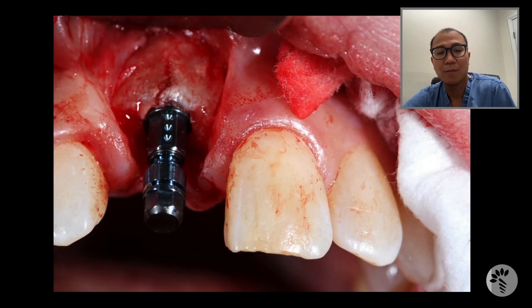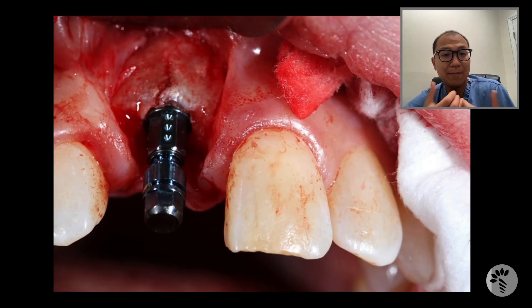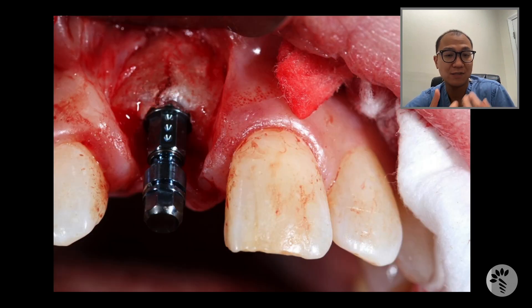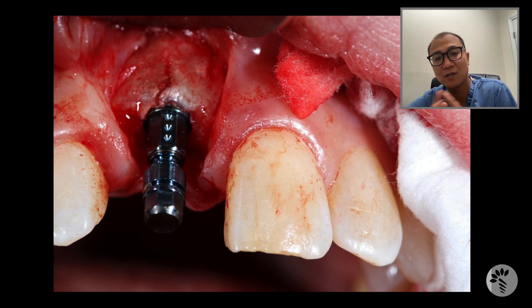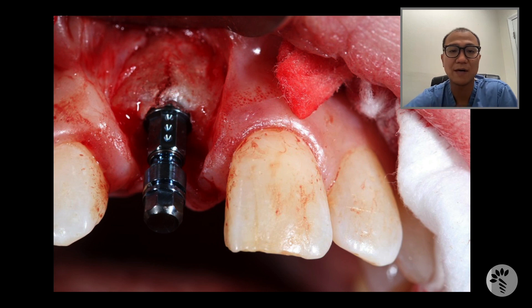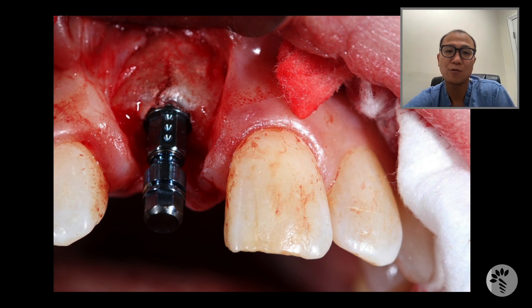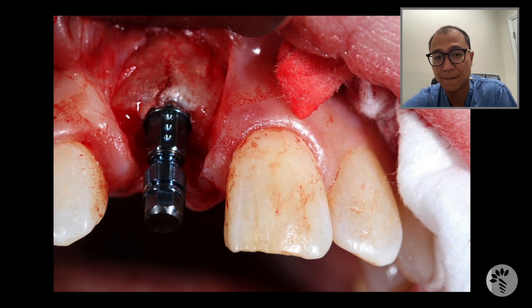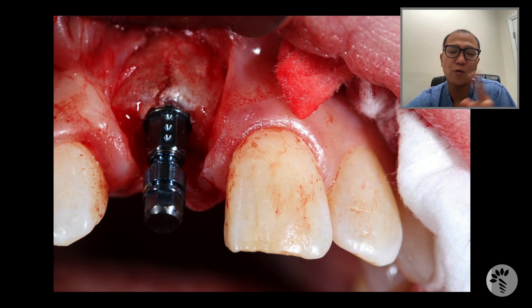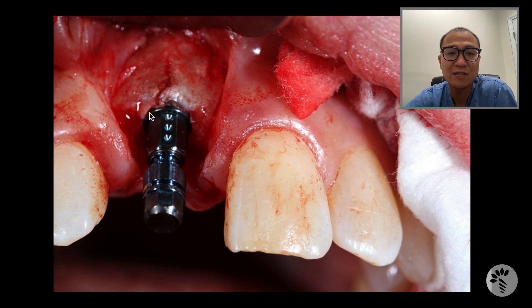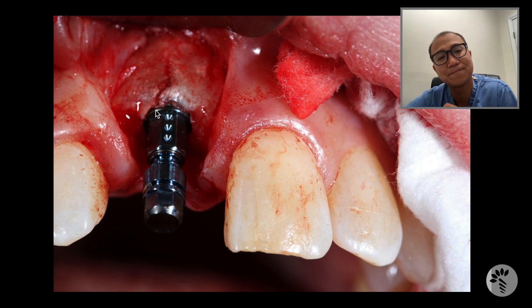Now I'm going to place the implant. The implant has been placed very successfully. Primary stability was about 20 newton centimeters, so I'm going to submerge this implant for further osseous healing. When you look a little more closely, there's a slight green fracture on the buccal plate.